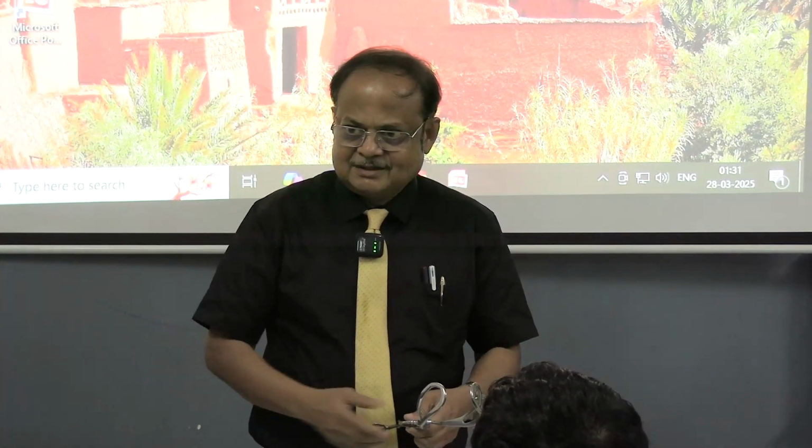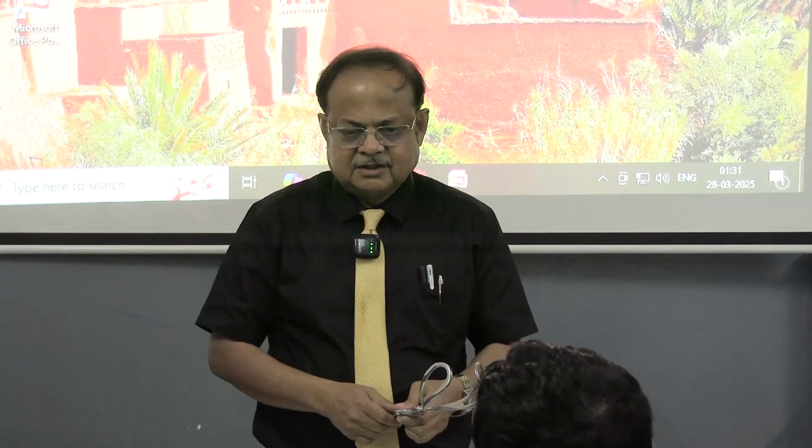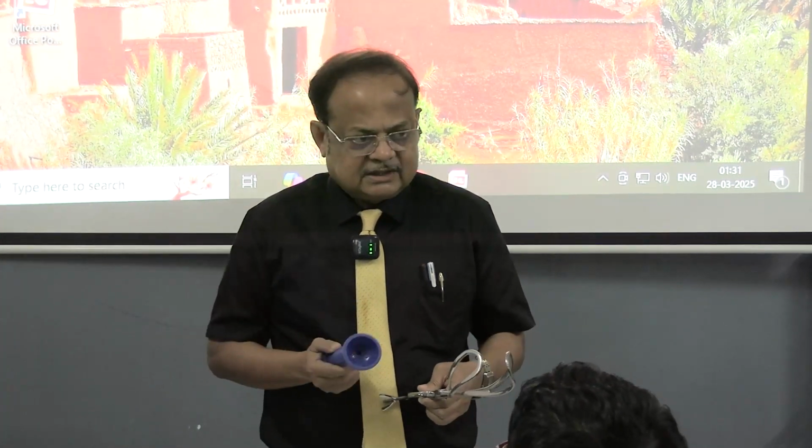There are so many forceps, tooth forceps, varieties of forceps, tissue forceps, Allis tissue forceps, different types of forceps. You say always obstetric forceps. And if they show this one, it is the ventouse, you can say ventouse, but better to say it is the ventouse cup with handle.